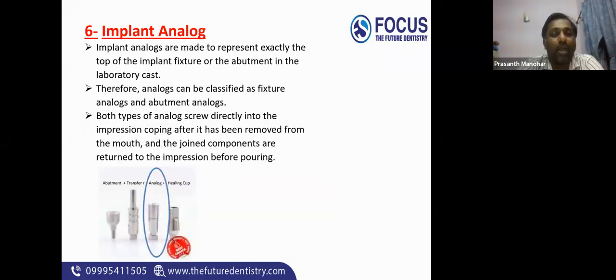Now coming to implant analog. What is an implant analog? The implant analog is the dummy implant which is placed in our cast. So it is the replacement of the implant in our cast. Understood? So the implant analog is the dummy implant or the working model implant in our cast, which will mimic the implant in the same way as in the oral cavity. Clear?